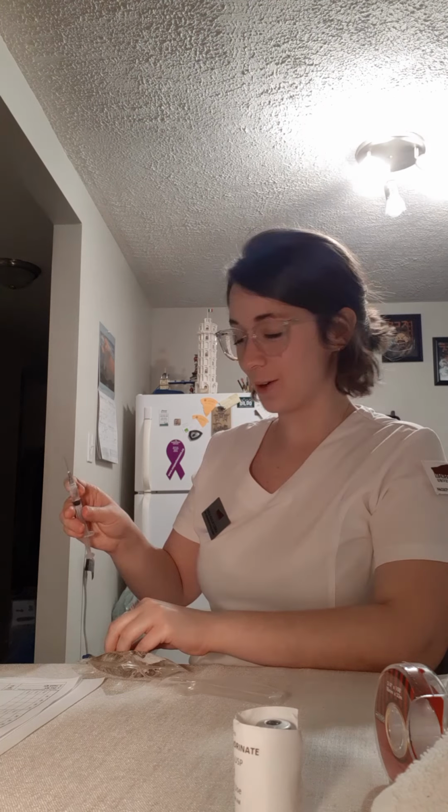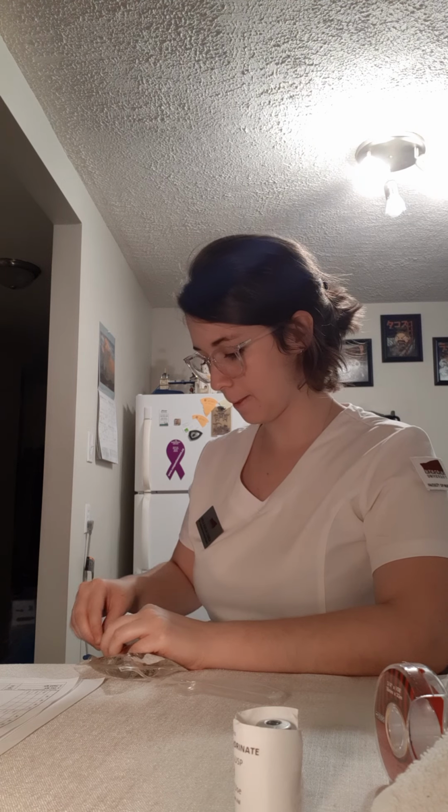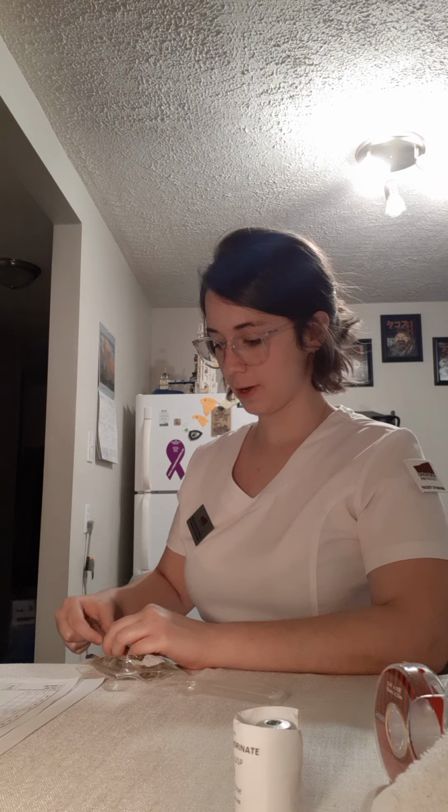Of course, it will be a new clean wipe, but I'm out of supplies at this point. So, okay, I'm going to wait for that to dry, and I'm going to inject it into the bag. Perfect. And now that goes into my sharps container.